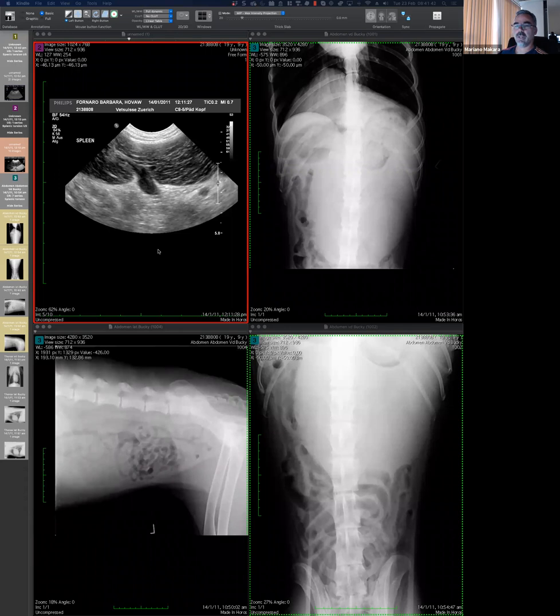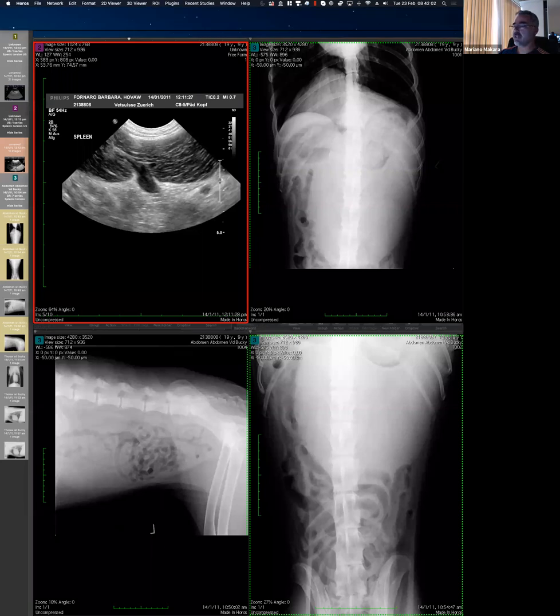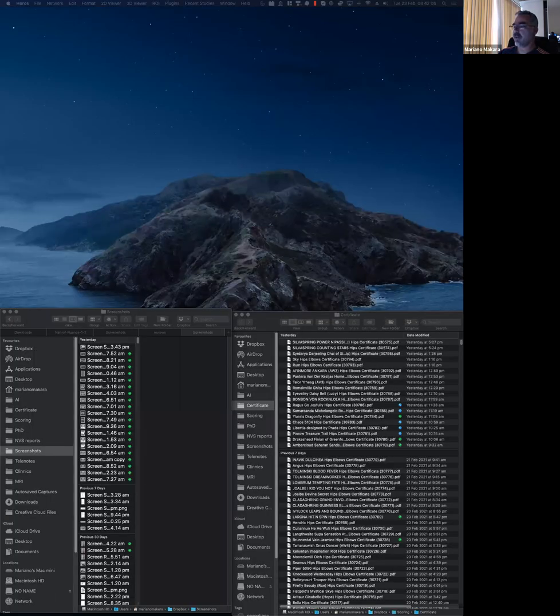Okay. Any other question? Otherwise, I have a little bit of another case. So I don't know if you've seen the connection between last time that we talked about a colonic torsion and today's case, which is another torsion. So there is a link. I don't think you can make the call about this case, but I'll share with you, and we may not finish today, but we can get started.